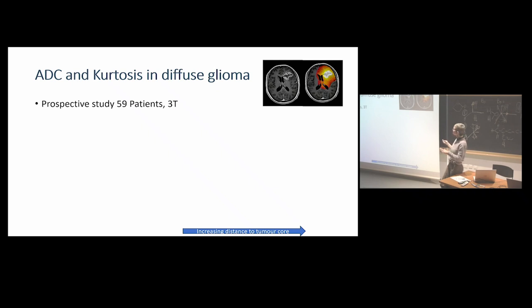So then in a T1 weighted image, the signal would get very, very bright. And you see that that happens in all these places where the tumor still can grow a lot, because in the center of this tumor, there will likely be necrosis. There is no nutrition coming in anymore, but at the borders of this tumor, it's still sitting there and wants to grow. And this is what you can see by giving contrast agent.